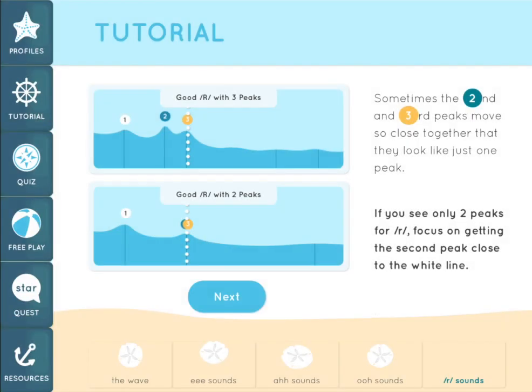Besides looking at where the third peak is located, we can also look at how close the second and third peaks are to one another. A good R sound has a very small distance between the second and third peaks. Sometimes they are so close together that they look like just one peak during the R sound. That's okay — a good R sound can look like either of the two images you see here. If you see only two peaks for an R sound, you should focus on getting the second peak close to the white line.